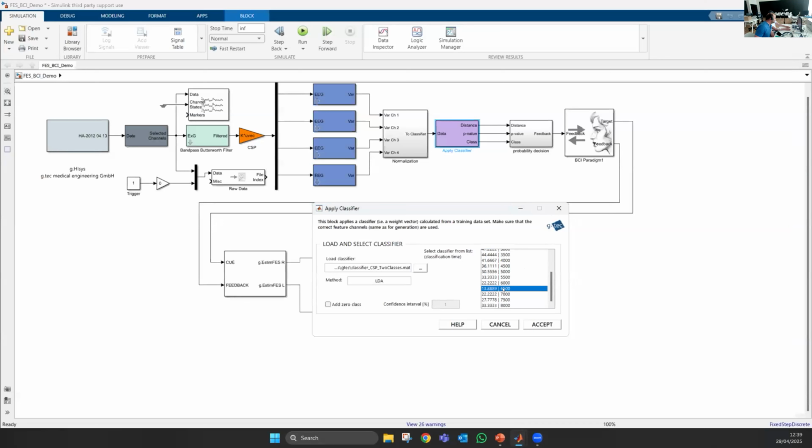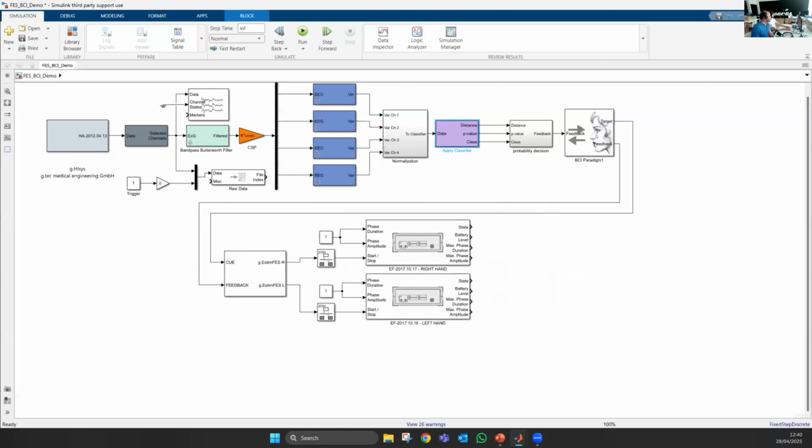So after around 6.5 seconds of the trial. The trial always consists of concentration, a fixation cross, then you see the arrow left or right, and then you do the imagination of the movement. Here we get the lowest error rate, and we accept that for our classifier.